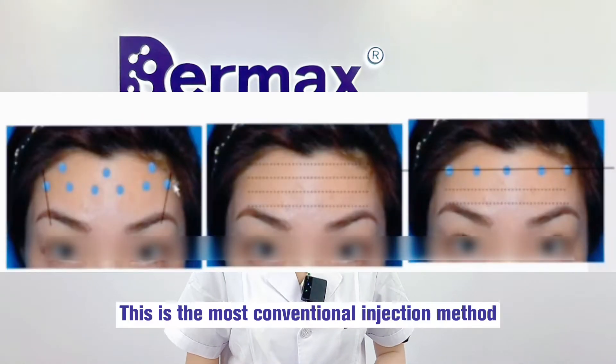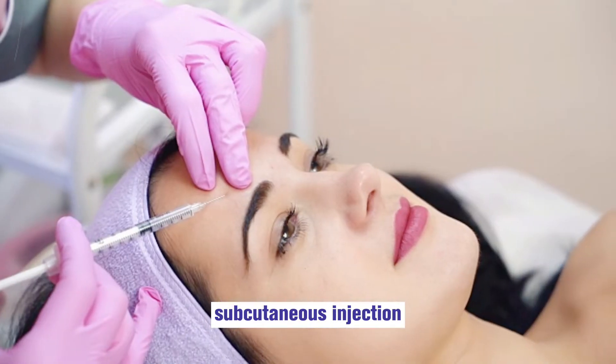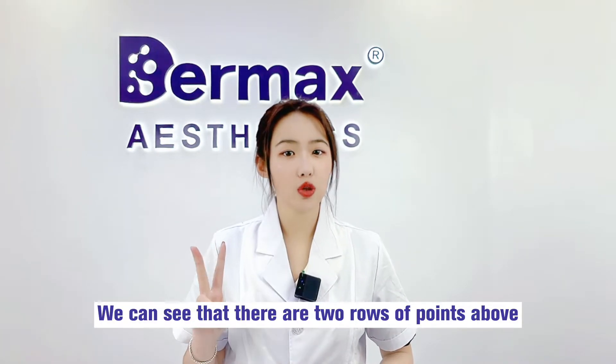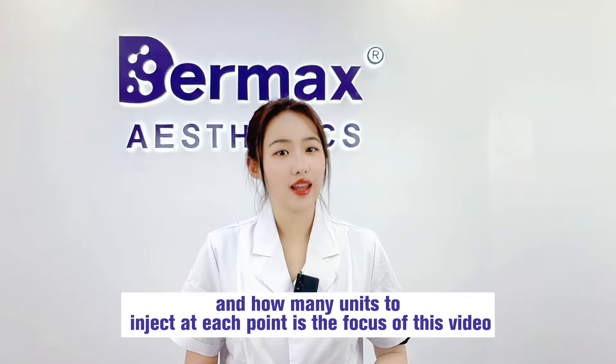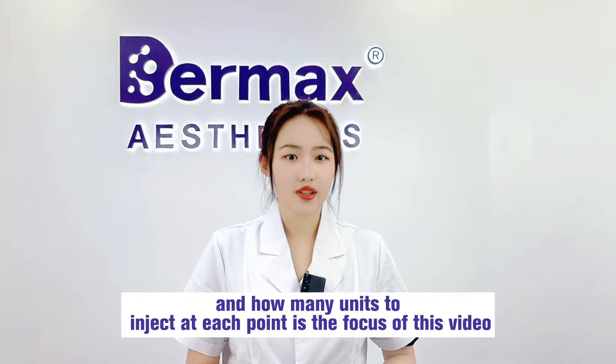Let's look at the picture. This is the most conventional injection method: subcutaneous injection. This injection method is mainly suitable for young people. We can see that there are two rows of points above. How to determine these two rows of points and how many units to inject at each point is the focus of this video.